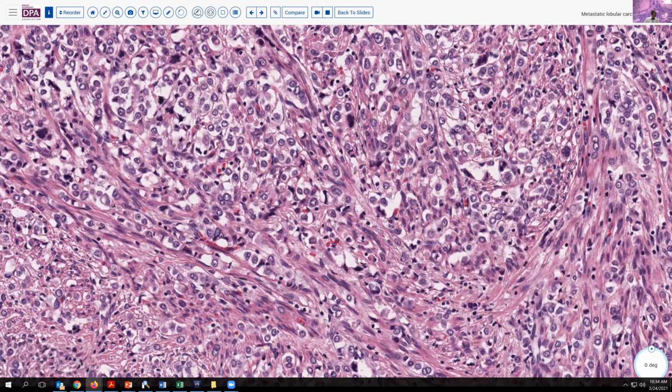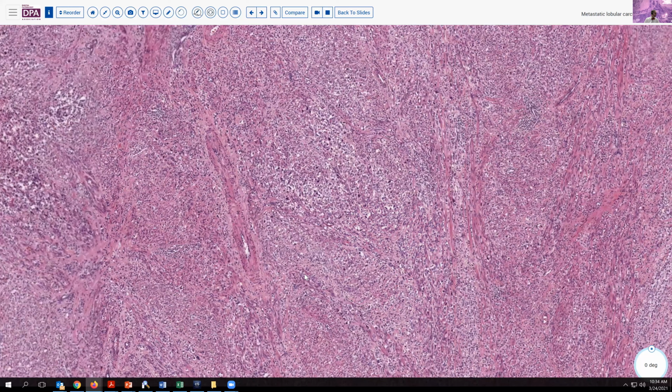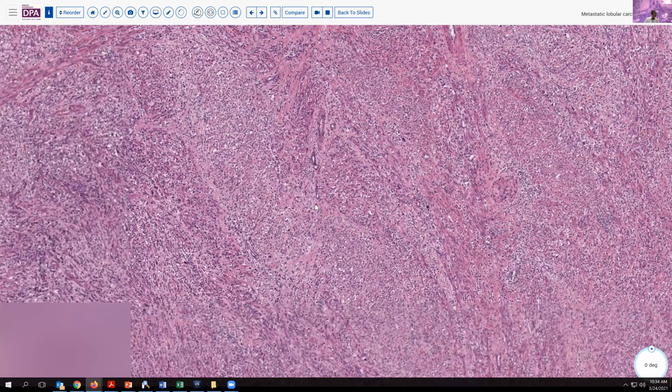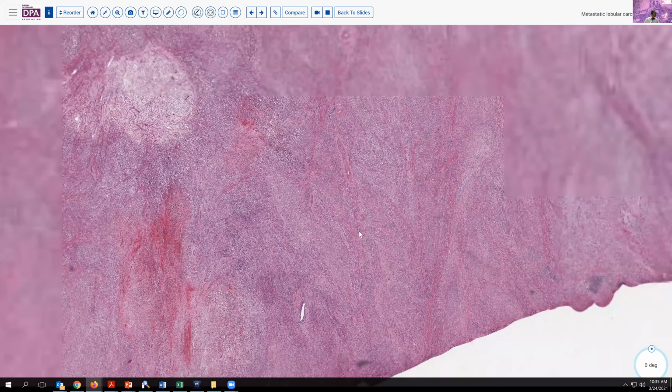And so as we saw, at low magnification, you might mistake it for a fibroma. But for finding the mitotic figures, the atypia, the epithelioid morphology that underlies this pattern, you could easily miss it. Here again, of course, markers may be somewhat deceptive because obviously hormonal markers may be positive in these metastatic breast cancers, although your stromal markers and so forth would, of course, be negative.